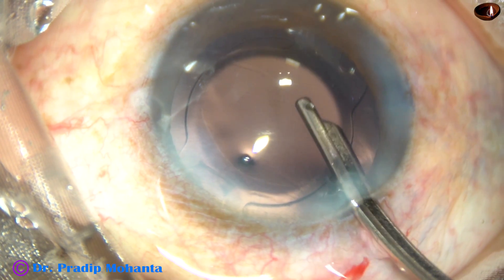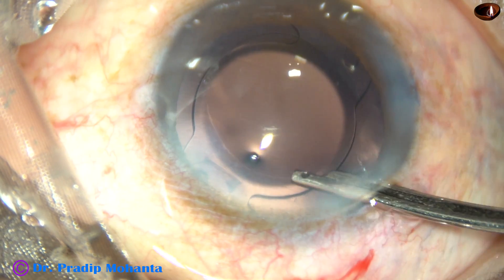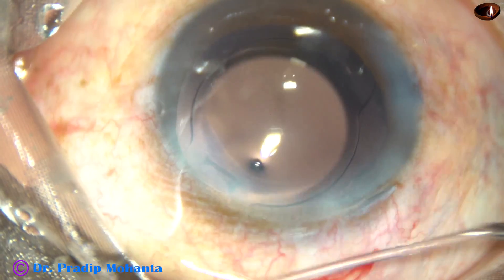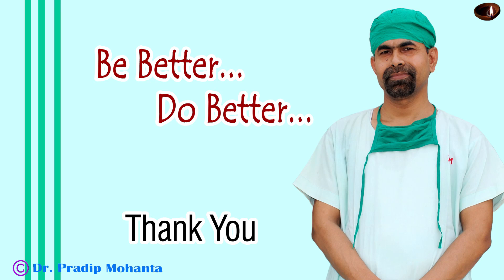This is the final lavage of the anterior chamber. The anterior chamber is formed very nicely and the case is concluded. Thank you very much for your attention. I hope this video will guide you in doing your first few cases of phacoemulsification. Please take help of your senior, watch this video again and again, and do your first few cases. Be a great surgeon and serve mankind with love, respect, compassion, and great surgical competence.